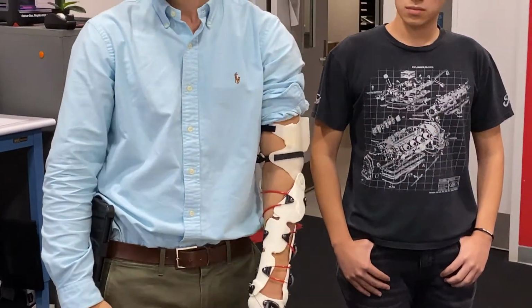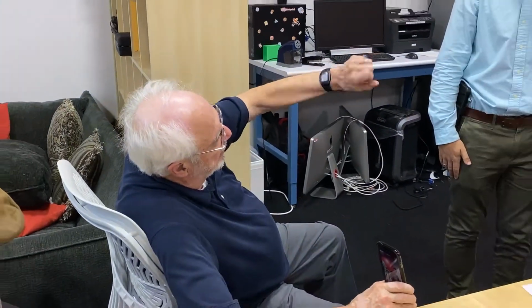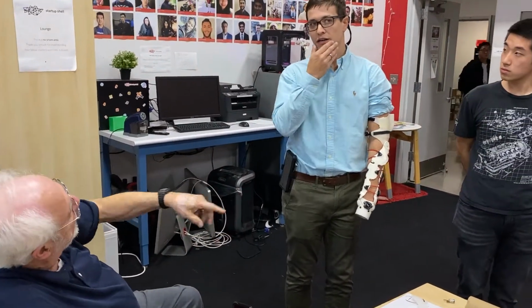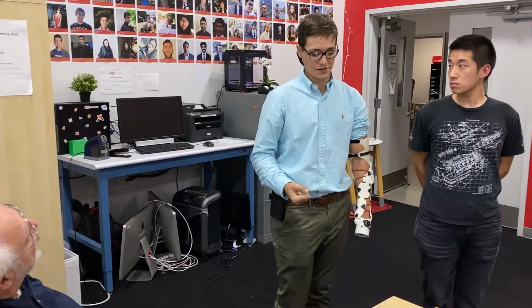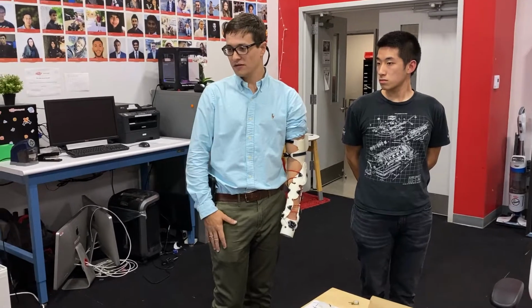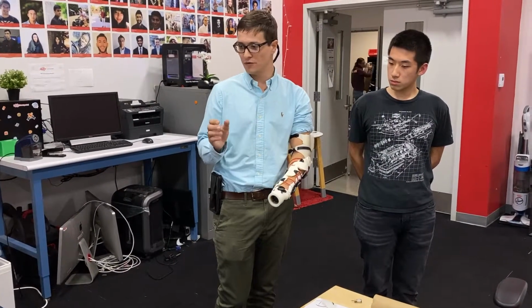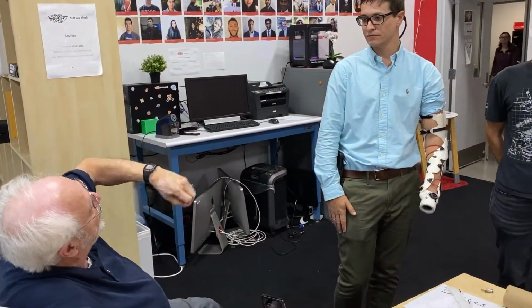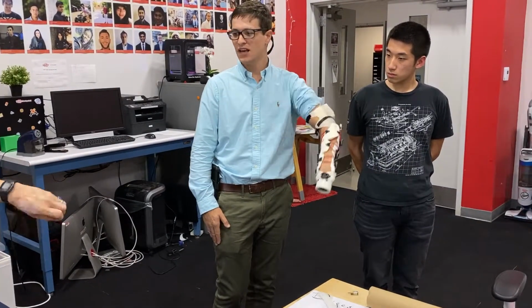So if your arm ended proximal to the wrist, how much pronation and supination could a person still do? Are you saying wrist movement without wrist articulation? Yeah, so wrist disarticulation, it just depends really on their ability. I haven't had much experience with it. This material is quite flexible, so if they have limited movement, it still allows for it. I just wondered how much they could do, like using a spoon in soup and stuff like that. The pronation and supination is kind of valuable.